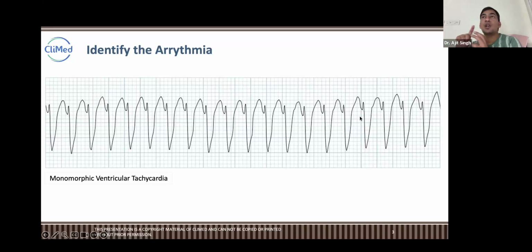That circuit will not be interrupted, but it will be represented in the ECG, like on your mobile it shows this Wi-Fi is not working. So in ECGs those impulses will be caught and shown as RBBB or LBBB. But in ventricular tachycardias, that pattern will not be seen.